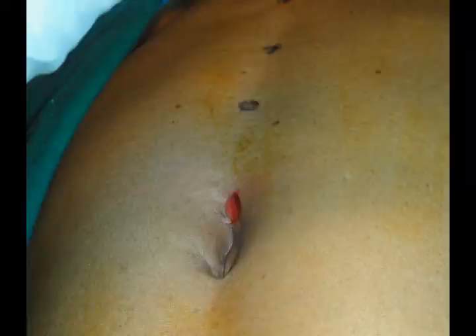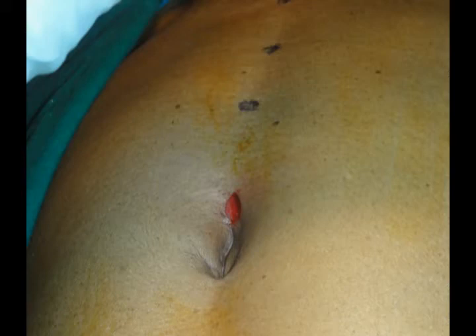Look at the small wound — that's for a 5 mm 30-degree telescope used for the camera. A 5 mm port is introduced through the small nick in the infraumbilical region, then a subcutaneous tunnel is made and a 5 mm trocar is thrust down into the retropubic space with very little trauma. It punctures the linea alba in the middle and a 5 mm telescope connected to the camera is passed through the port.